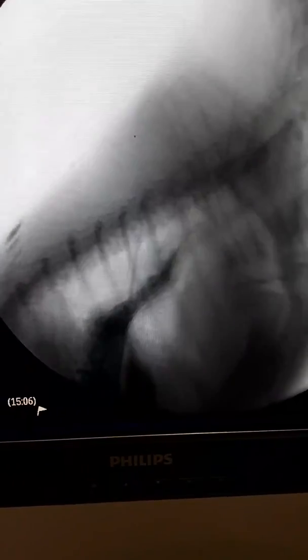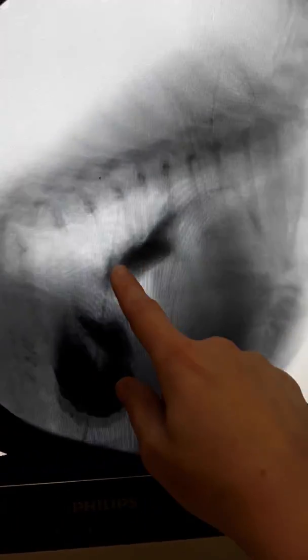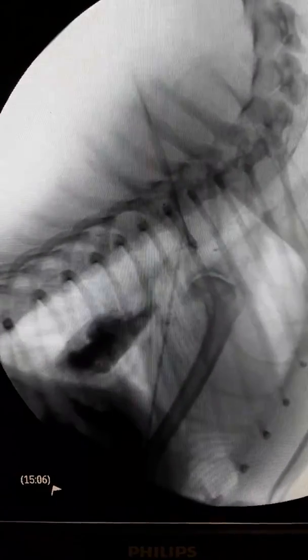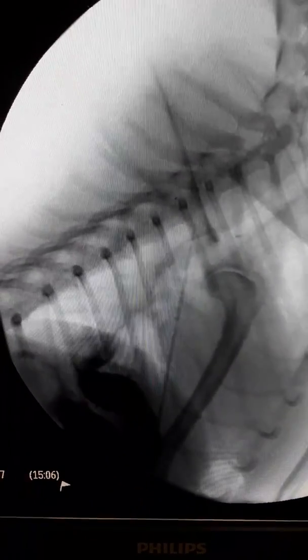Here's another swallow — this is of slurry material. We see her swallow that pretty well. It gets down to the stomach, but you see it sloshing up a little bit and not making it into the stomach immediately. Then a little bit more material comes down, gets to just above the lower esophageal sphincter, opens, and goes through nicely.